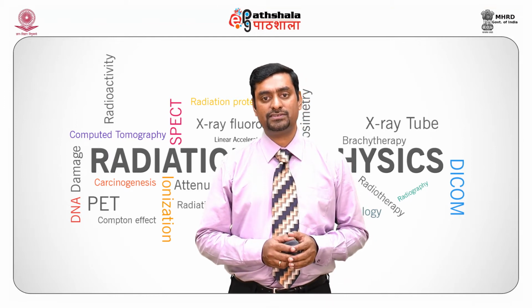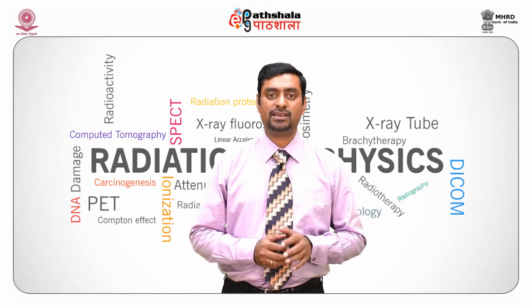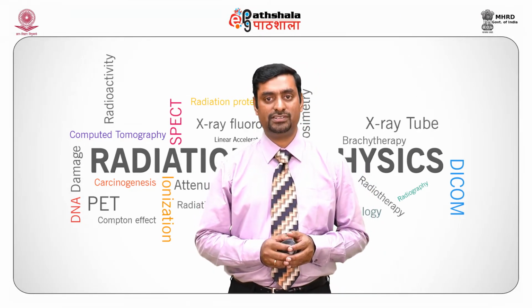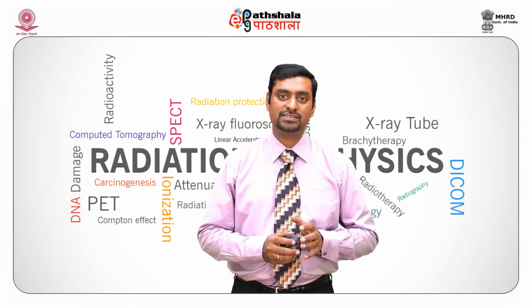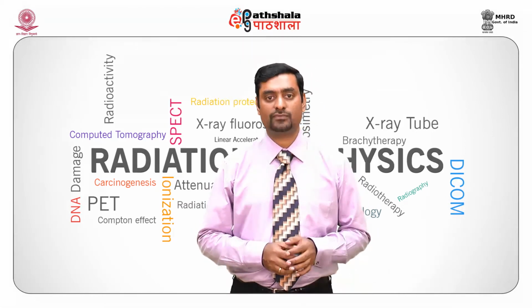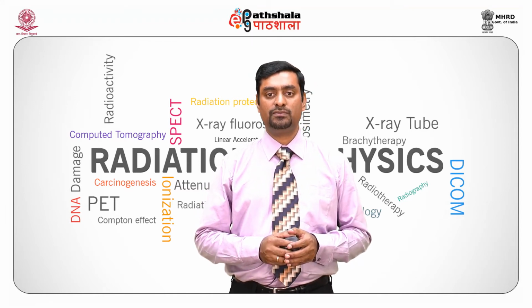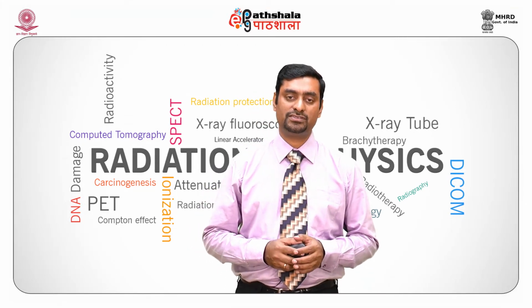The transmitted X-rays interact with the cesium iodide crystal and produce light. This light is converted into charge by a light sensitive amorphous silicon photodiode element which is integrated to the TFT. TFT acts like small switches. A charge collector electrode captures the signal and the capacitor stores the signal. All elements are connected in a row and column matrix, and using suitable algorithms it is possible to process the image, and the image can be viewed on high resolution monitors.